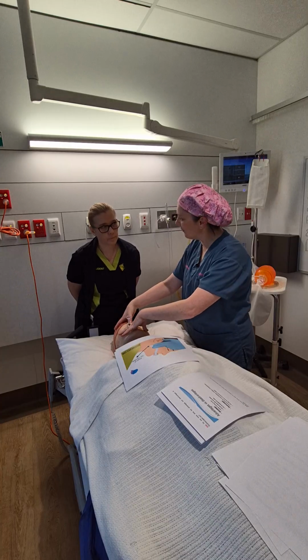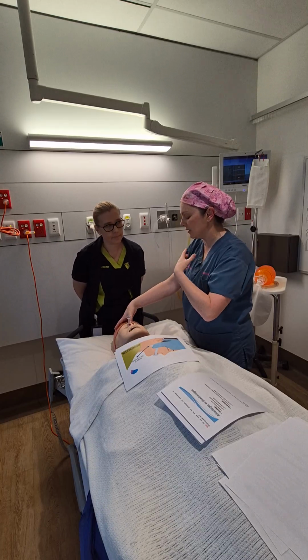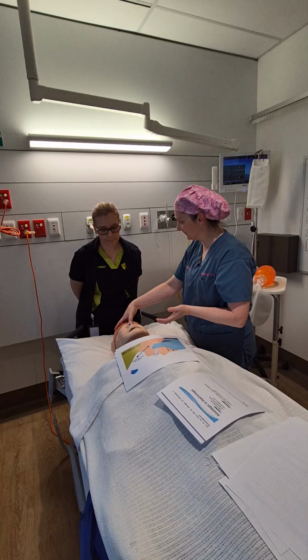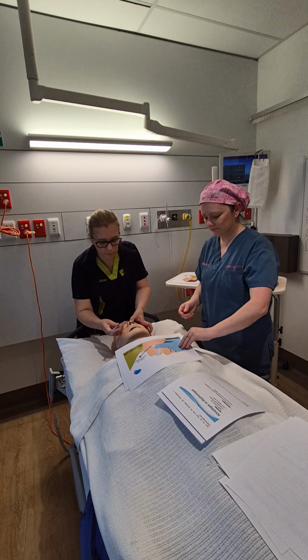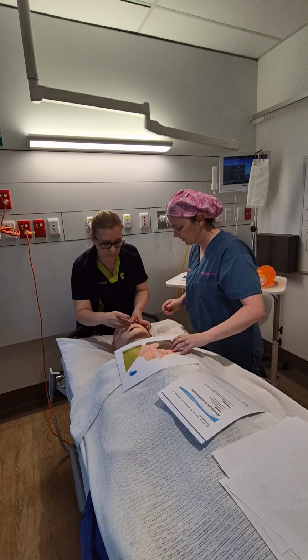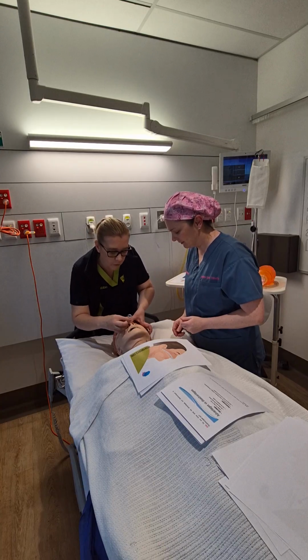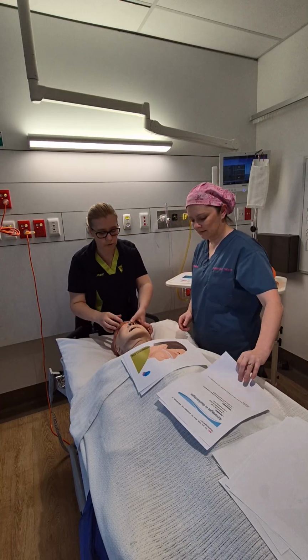It quite often gets caught on the back of the tongue, which is fine because what you're doing is forcing that tongue forward out of the way to open the airway. So you can give it a little bit of a twist, that's fine, and then it just goes all the way in until you get to the flange there. Wonderful. So I'll take it out and I'll get you to give it a go. I also have a picture here as well. Oh, sorry, I missed that. Can we do it again? Yeah, sure. So I'm pulling the nostril up. Wonderful. Excellent. And I'm going to follow the path down. No resistance, so I'm good.